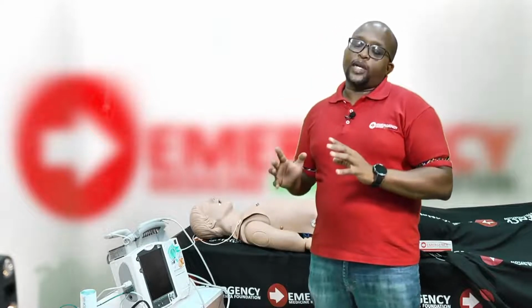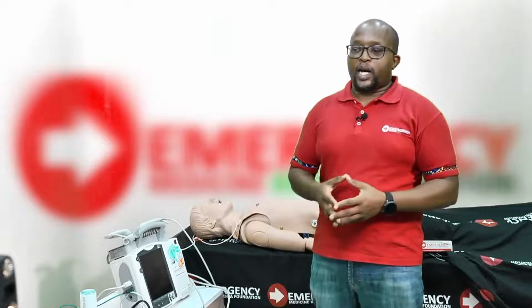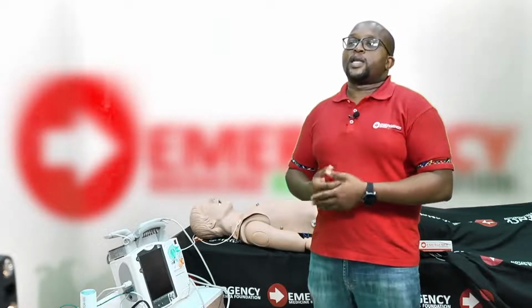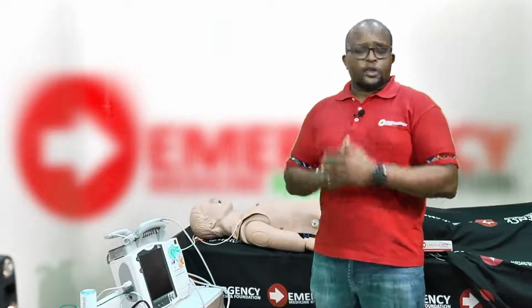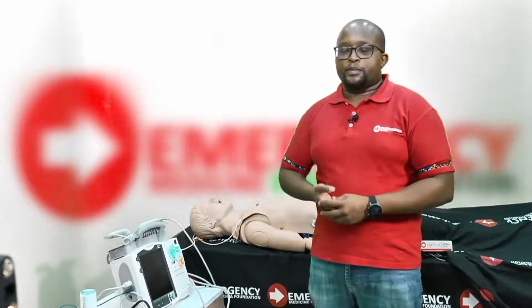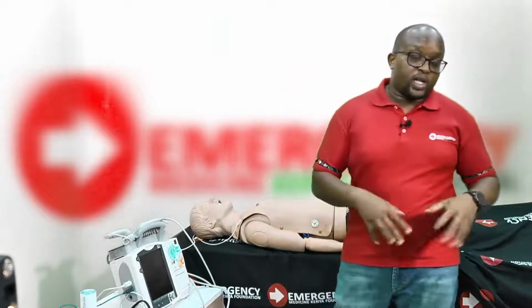Early defibrillation has also been shown to improve patient survival, and that's why there are many programs that look at how to defibrillate patients in an out-of-hospital setting, so that patients are defibrillated as soon as they go into cardiac arrest, because this increases your chances of survival. If shocked immediately after going into cardiac arrest, there is as high as almost 90+% survival with good neurological outcome.